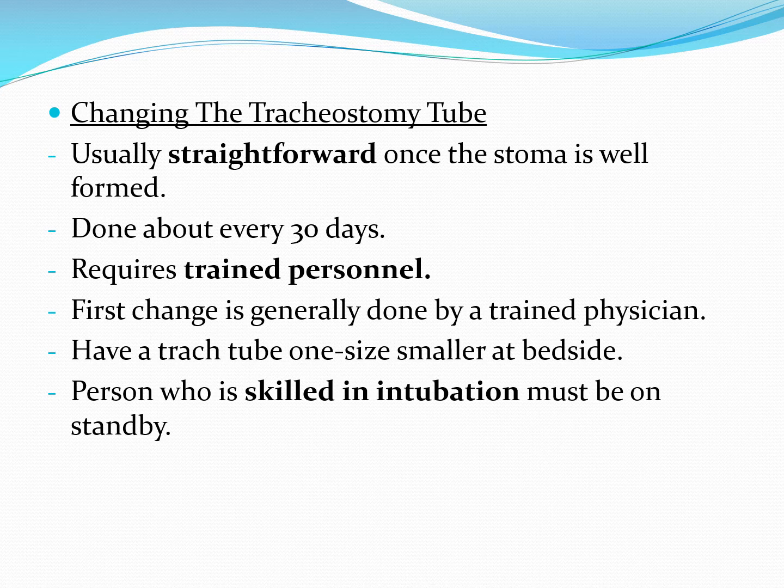And then most protocols call for having a trach tube one size smaller at the bedside, in case the existing tube is taken out, let's say it's an 8 for an adult, and a new 8 won't go in. You'll have a 6 that you can actually put in there. I've changed trachs in the hospital, but I also did home care. When I did home care, our protocol was to have one size smaller. So anytime we were taking a tracheostomized patient home, if they had an 8, they would automatically have a 6 as well with the initial equipment delivery.